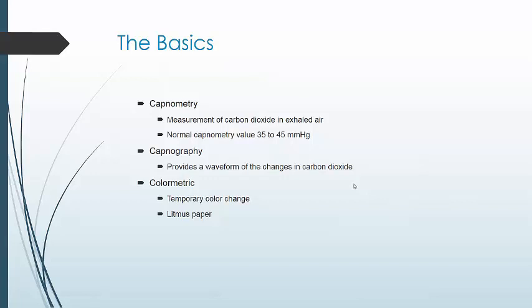and that's what you'll see a lot of times in the field, in the house, when you first intubate somebody or something like that, and that does a temporary color change. So that's good for an initial verification, but then you're going to want to follow it up with actual capnography in order to have a definitive evaluation of that airway.